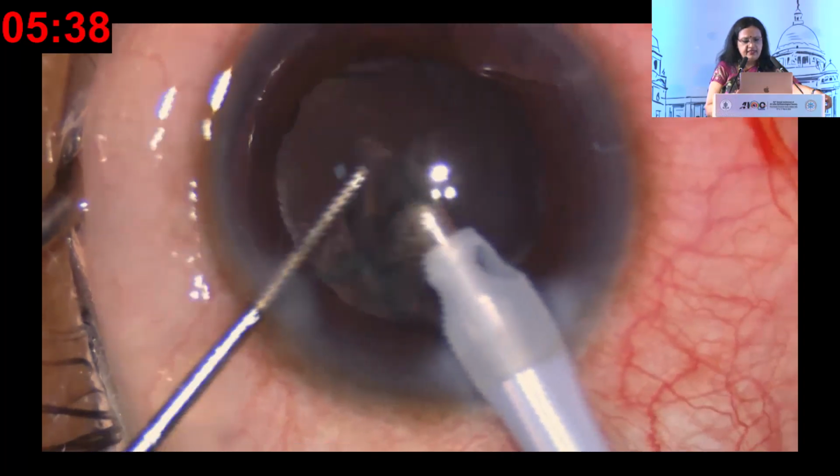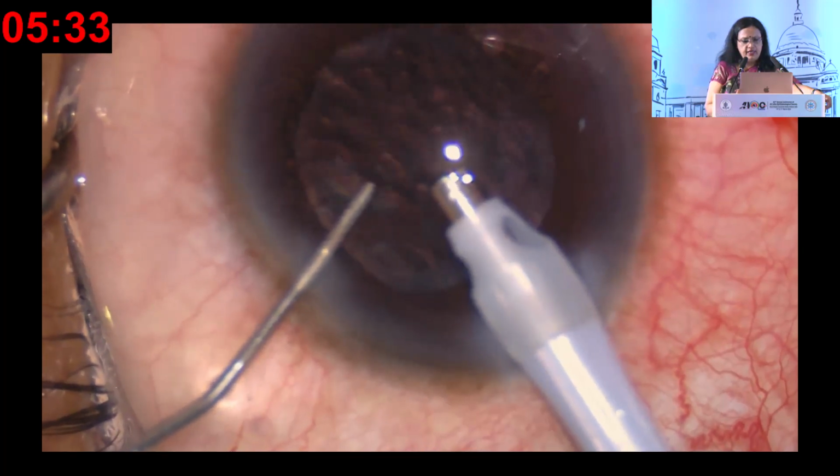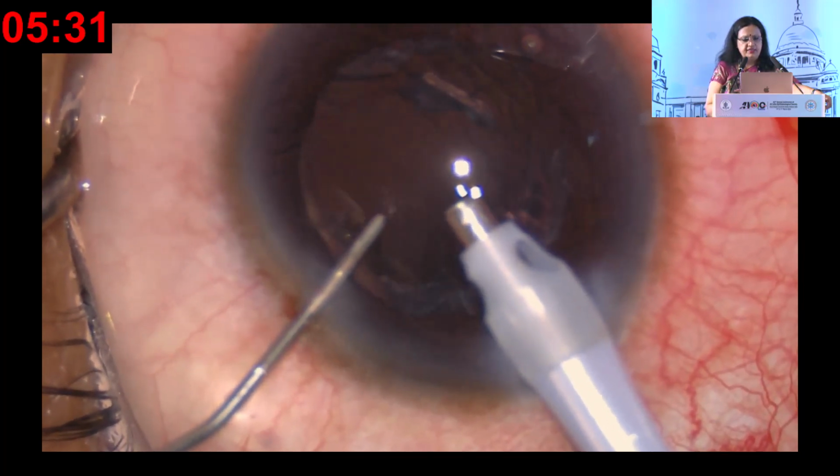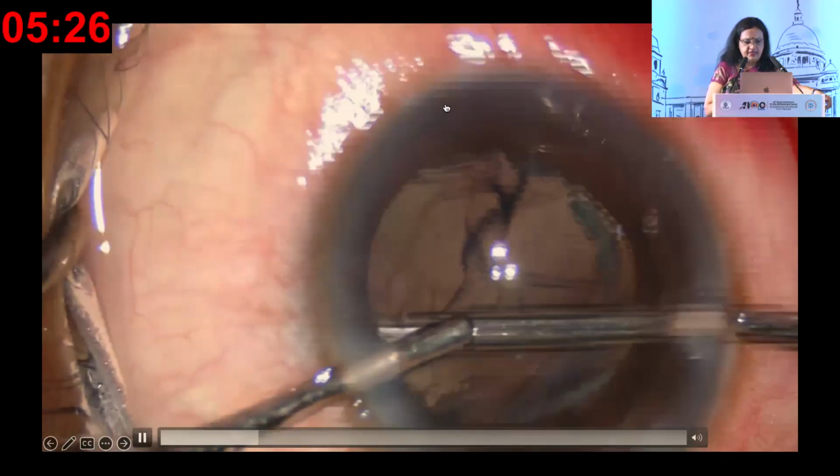This is again another case where there is a very small PCR which has been noticed by the surgeon. And so immediately, what's happening? He has kept his phaco port inside, and you can see the very small PCR here.